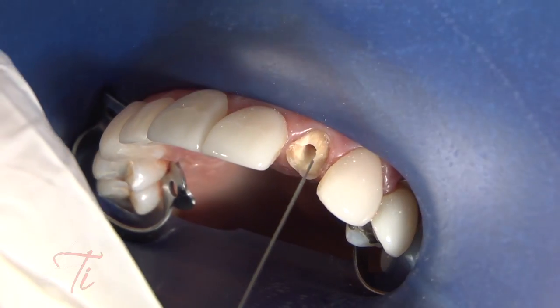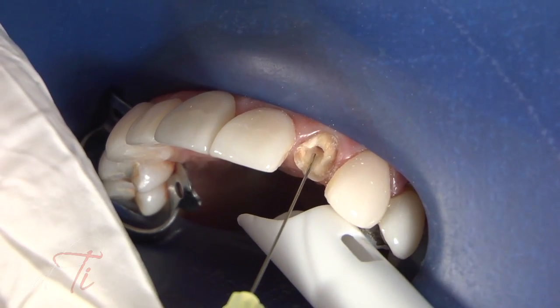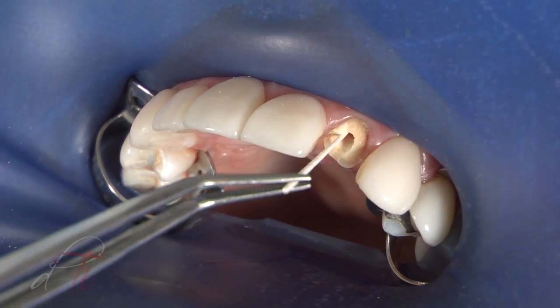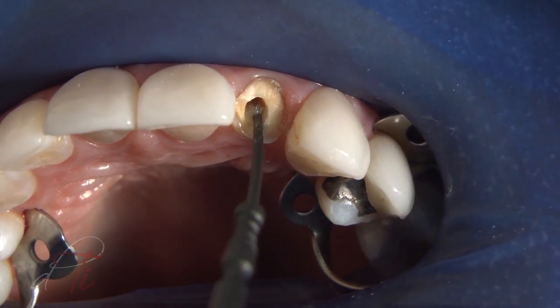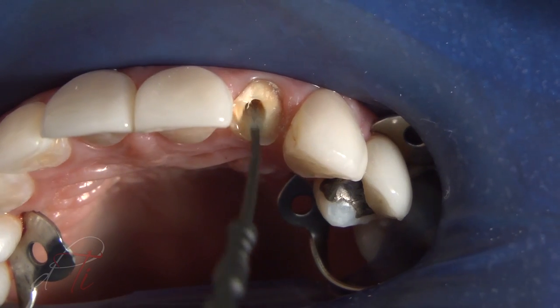Any residual debris is irrigated with water using a small gauge needle syringe, and the intra-radicular channel is lightly air-dried with an endodontic paper point. A dual-curing self-etched adhesive, Futurabond DC by Voco, is applied onto the walls of the channel with an applicator and an endodontic paper point to the base of the post space.